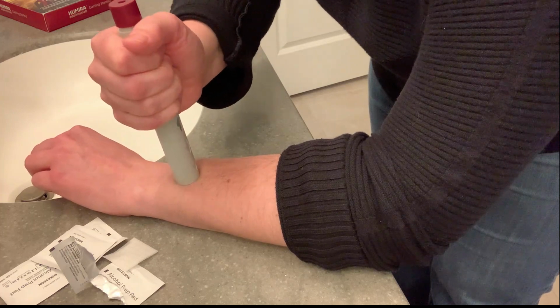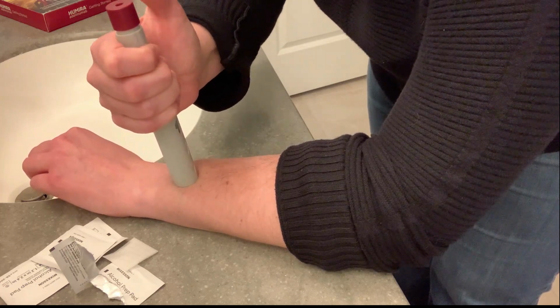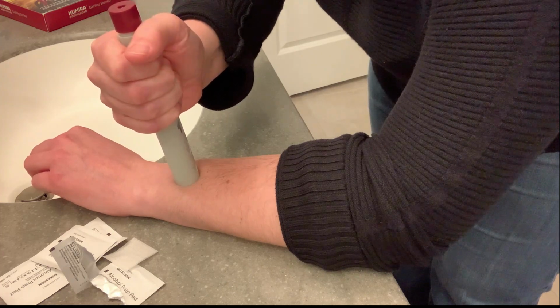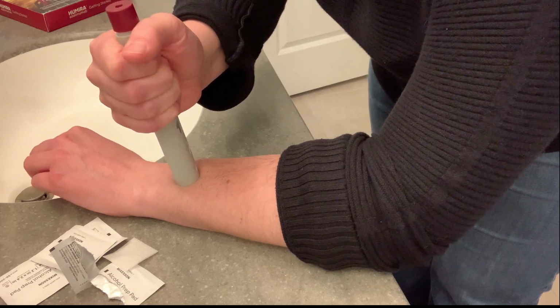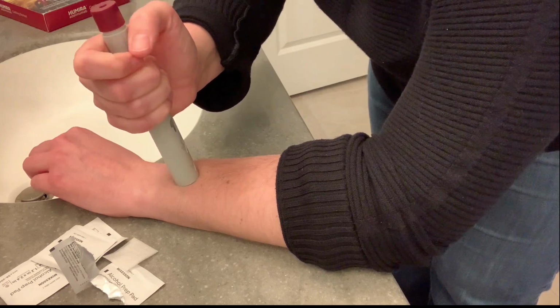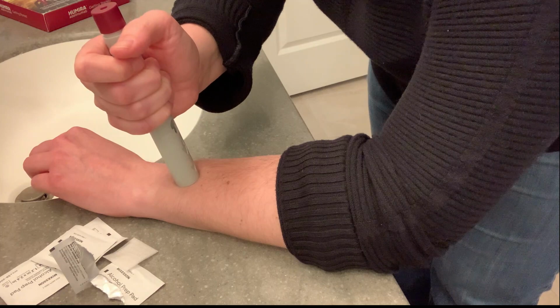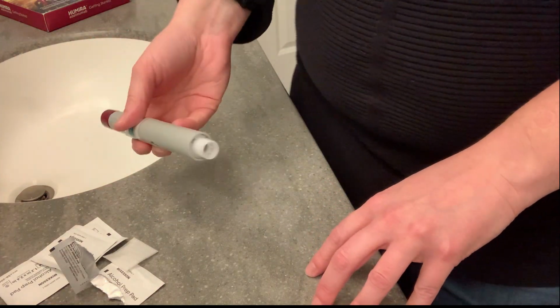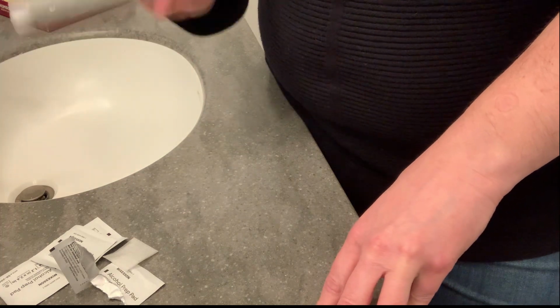And when you're ready, you pull the trigger and you just wait 10 to 15 seconds. You'll see a plunger go down in the window on the side. When it's at the end, you know you're ready. And that's it. Once you're done, you can put this in a sharps container.